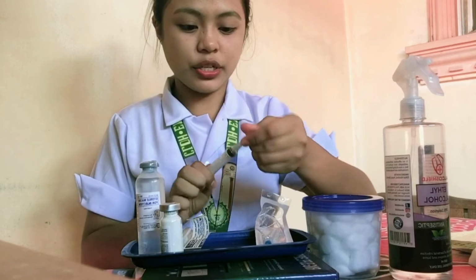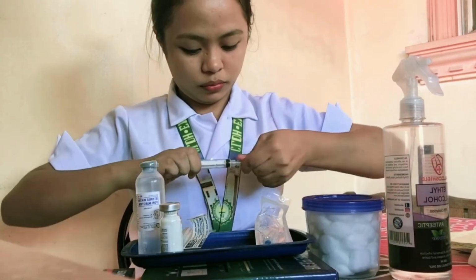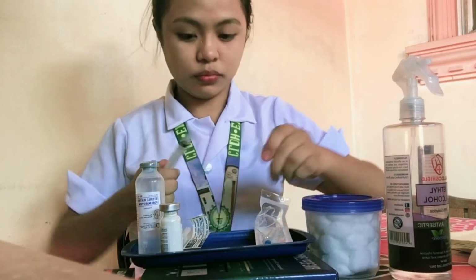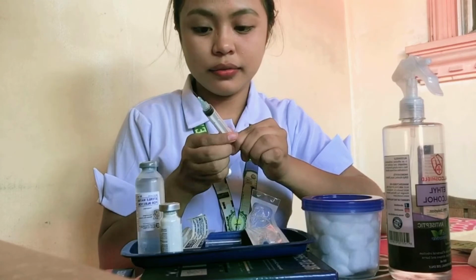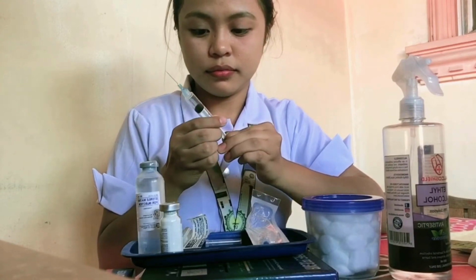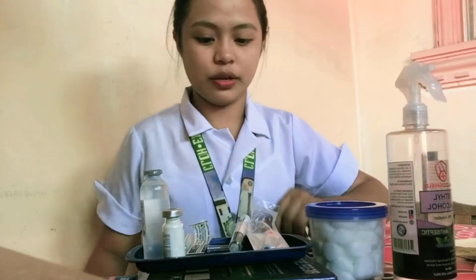So we need to inject air at 3 ml. Now we need to get 3 ml of sterile water.